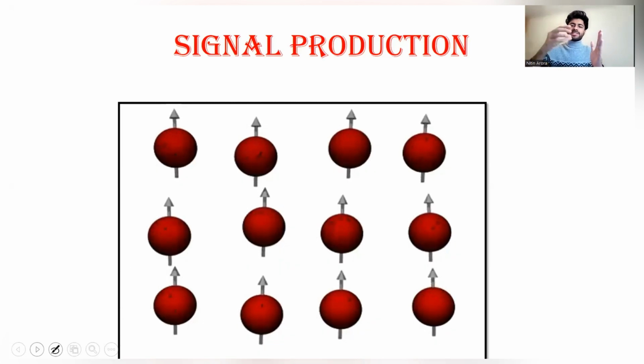The radio frequency signal changes the direction of these protons further. If these are vertically placed now, they will be horizontally placed afterwards, after the radio frequency signal strikes the protons. That means there is a change in the direction of the protons, and a change in the rotation speed of the protons.